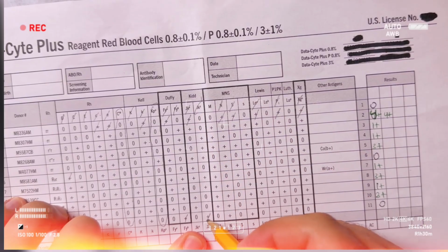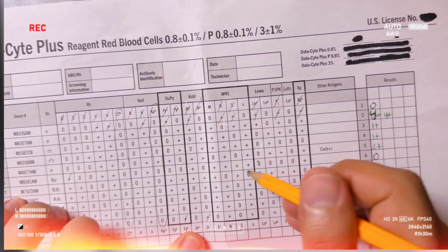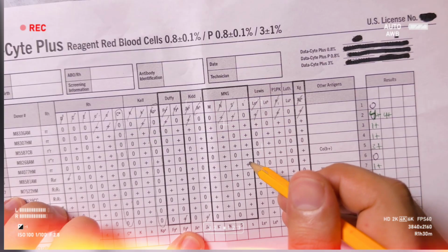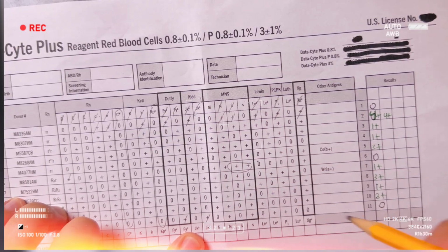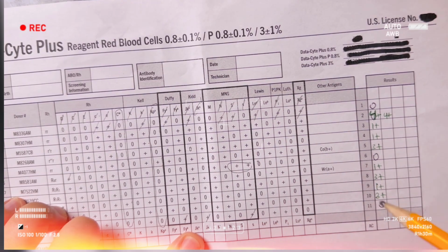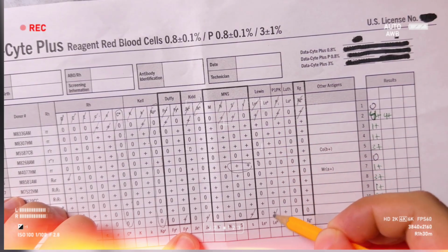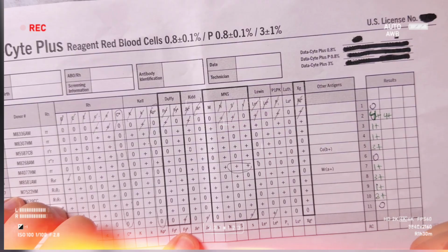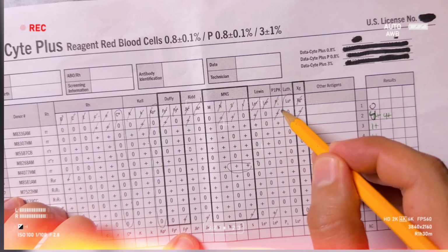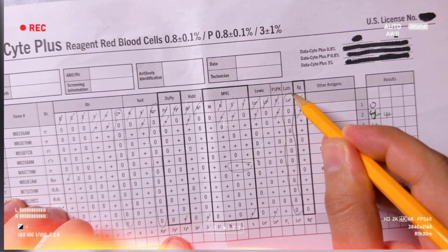JKB we can use the, so small s is, yeah, on the 6th one we have a heterozygous, but we have one homozygous for the small s too. And we will also rule out the Lewis B. And Luther we can leave, because Luther is not clinically significant and there is no proper reaction here.